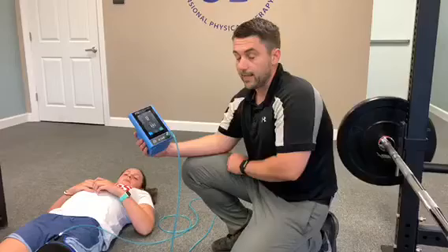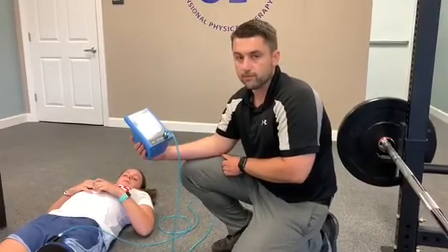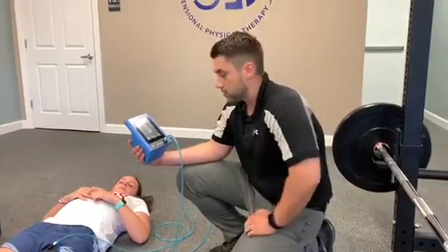Usually we have to get 80% of our one rep max — which is how much weight you can lift for one time — to gain strength. Now we can do that with just 20% using this machine.